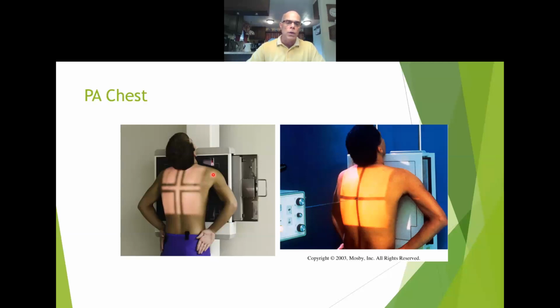And what this turning of the humeri towards the IR is going to do is take the scapula and pull it off the lung field laterally. That's the most important thing, and that's the one thing we always look at when we're looking at student images. This movement will rotate the scapula outward and laterally to reduce superimposition of the scapula with the lung field.